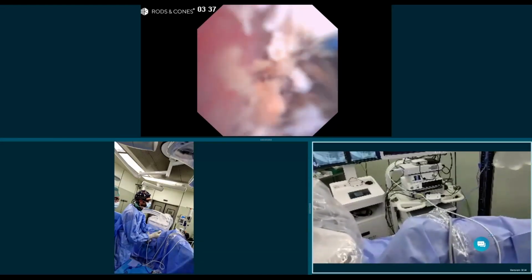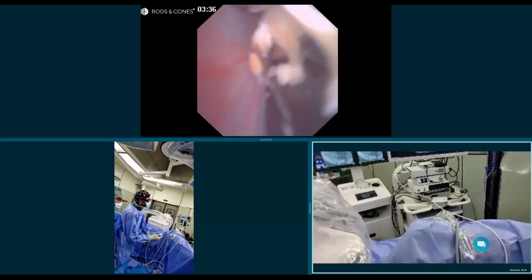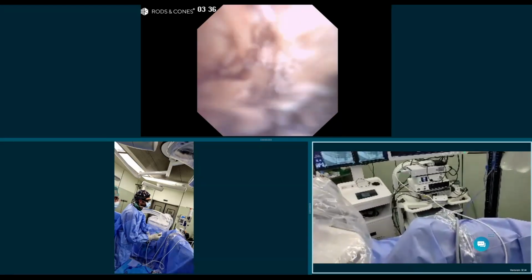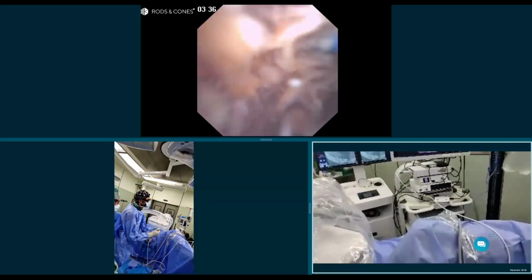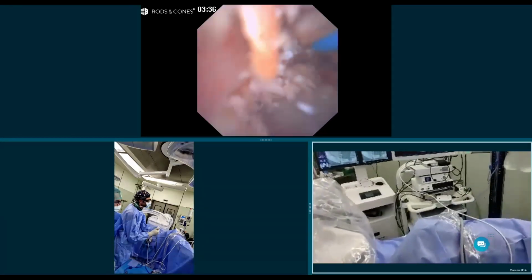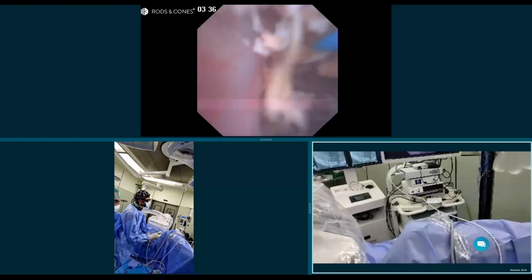I'm going to ask for a double J stent because this patient had a positive urine culture and probably a struvite stone, so I wouldn't leave her with a single J stent, even if she was pre-stented. This is completely debatable. There's no evidence. The surgery went well. It has been very quick. You can see that the Pusen has a timer there. We're not even half an hour in, and it's going to be a half-hour surgery. But as this patient has a positive urine culture, antibiotics, and a struvite stone, I would rather not have increased pressure at any time, and I would rather she have a double J stent in place for at least 1 week.